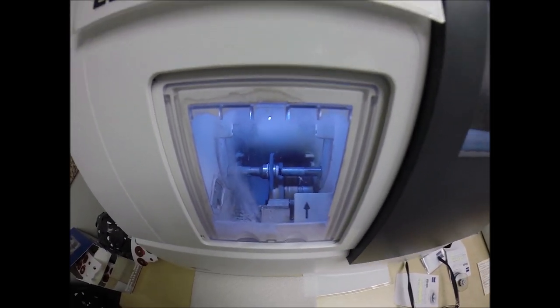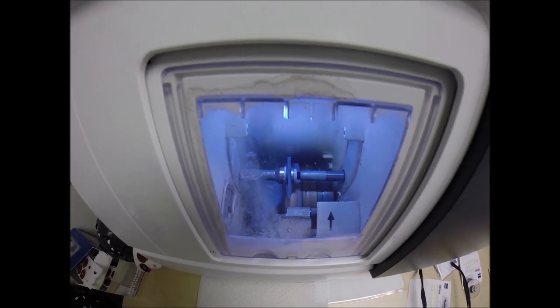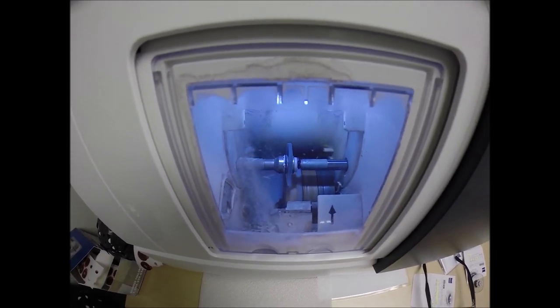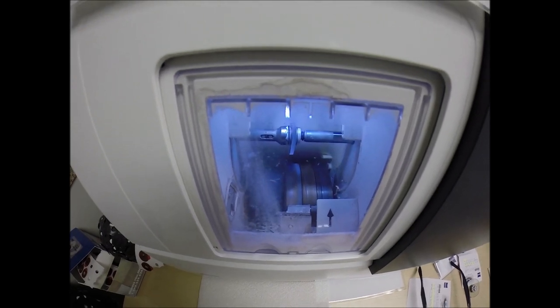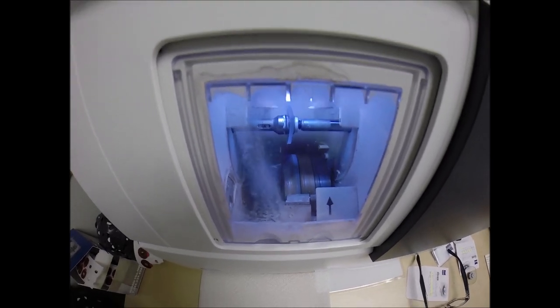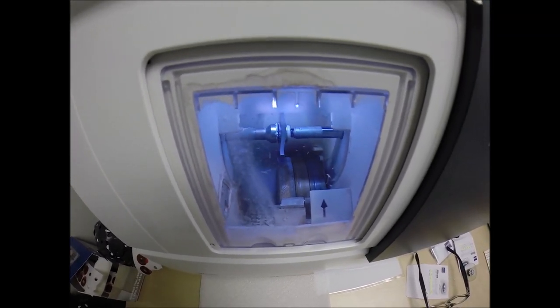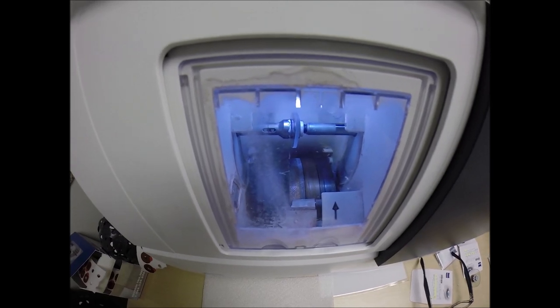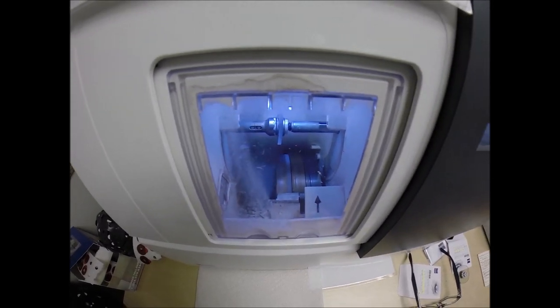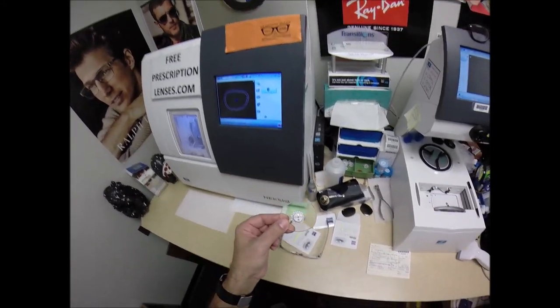These lenses also have 100% UVA and UVB protection. Most companies — and I'm guilty of this myself through SLR — have UVB protection up to 380 nanometers. Zeiss is the only lens that goes up to 400 nanometers, the most complete protection from ultraviolet light. They have so much protection that they have partnered with the American Cancer Society. Long-term exposure to UV is what causes cataracts in people, so this will offset cataracts much better.